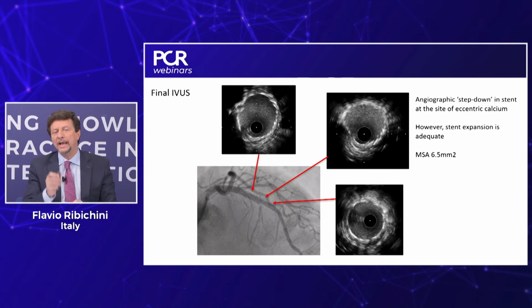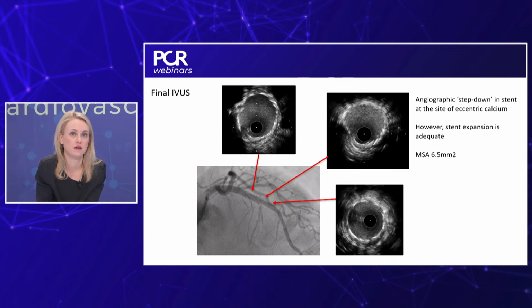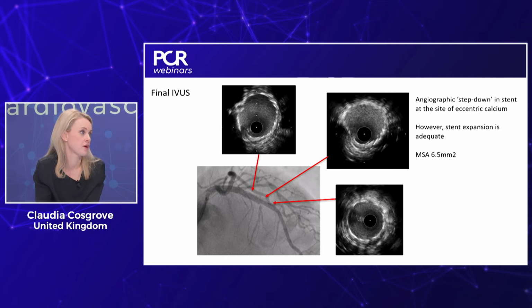Let's suppose you don't like the result. Could you go again with an IVL catheter and expand the stent further? It is possible. I think it's an off-label use of the shockwave balloon, but it has been done, and I've done it when it's a last resort, I'd say, but it can be very effective because it reaches that calcium behind the stent. So it's best to prepare the calcium the first time round before you put the stent in, but as a bailout, as a last resort, it can be used inside a stent.